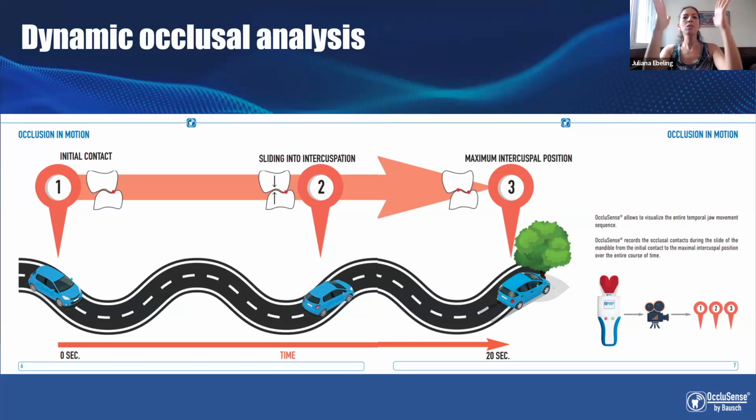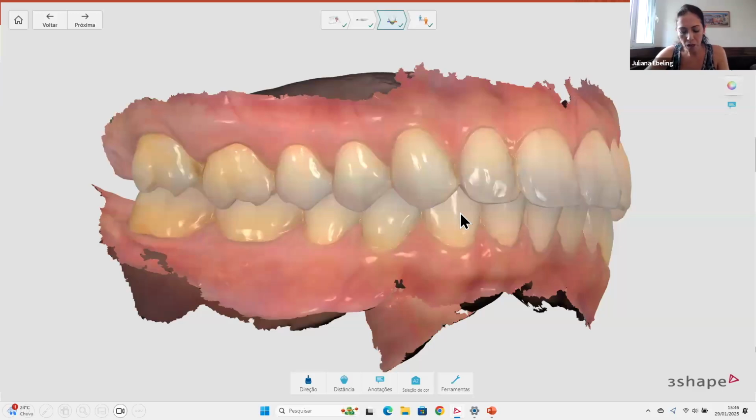At the end, all the teeth are together, but for example, in 6% of the movement, I have only that tooth with a high intensity of force during the movement. This is really helpful for non-balanced contacts during lateral movements. It's really important when we know how to use this information to analyze cases. So I will bring you some cases, how to analyze them and how to apply this in the clinic.